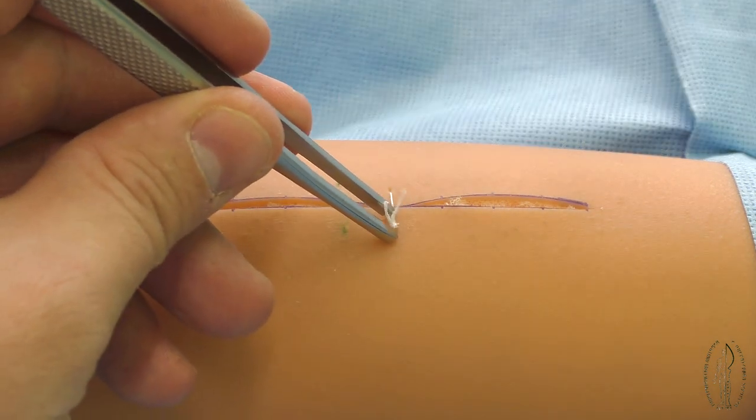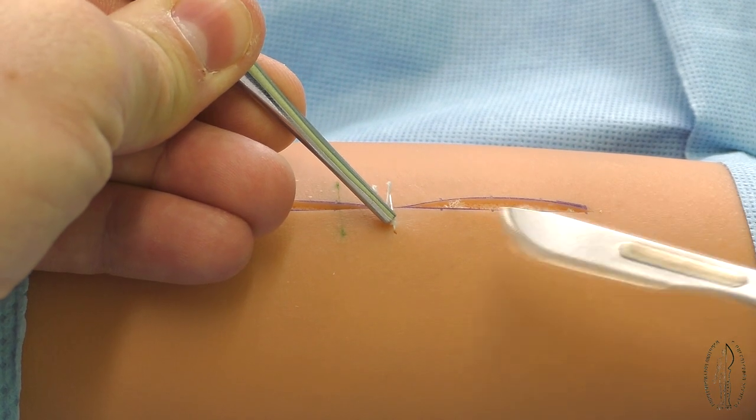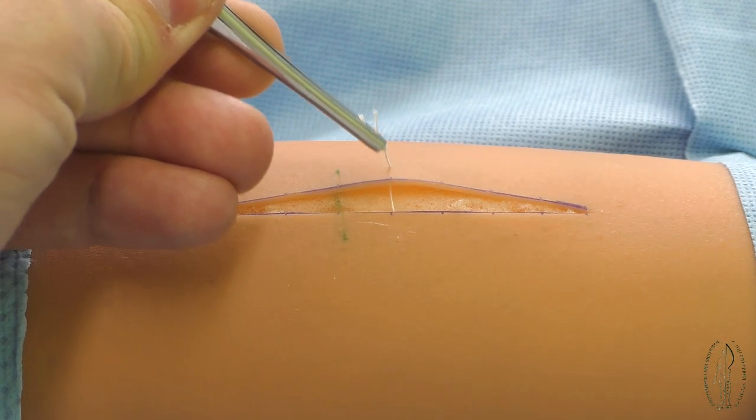A scalpel can be used instead of scissors for removal of a suture. In this case, after a knot tightening up by tweezers, the scalpel crosses the filament.